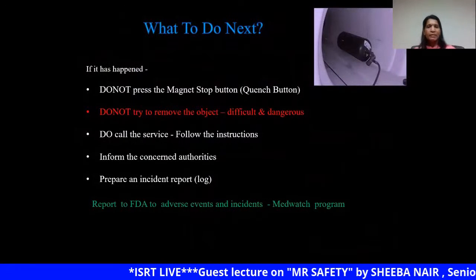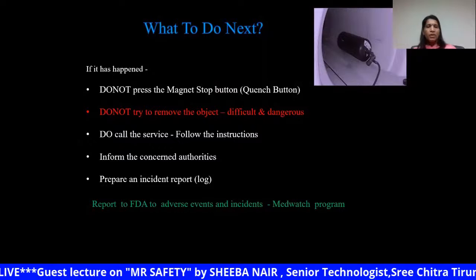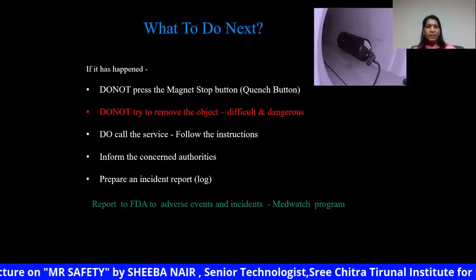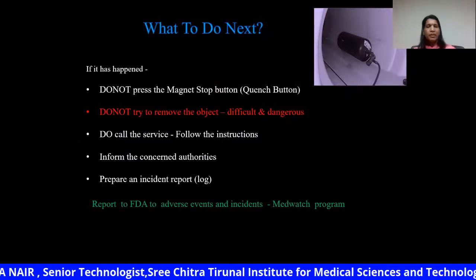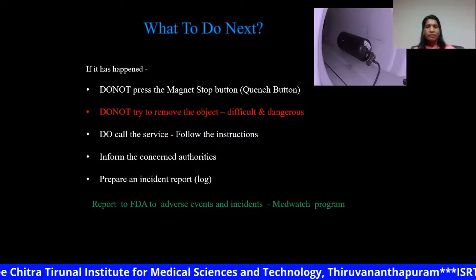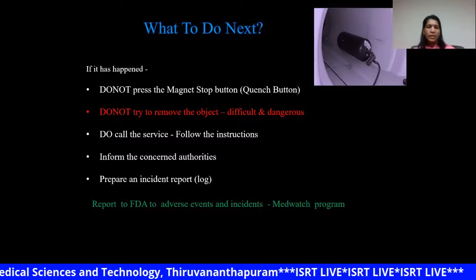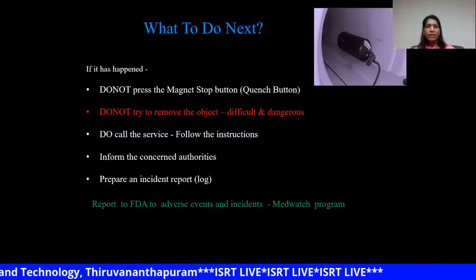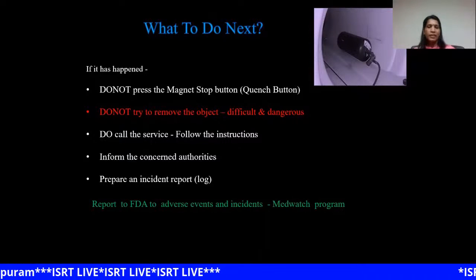So what to do when such an incident occurs? Do not press the quench button immediately. See if there is anyone pinned or any safety risk for the individual. Do not press the quench button. Do not try to remove the object, as this can produce additional hazards.